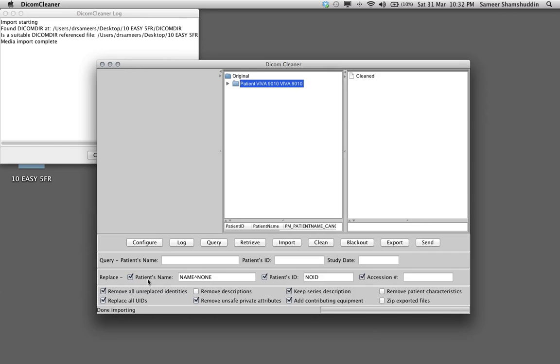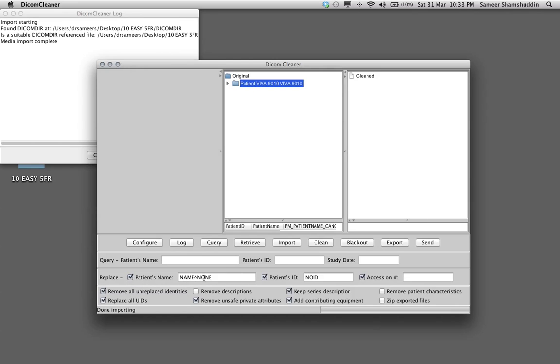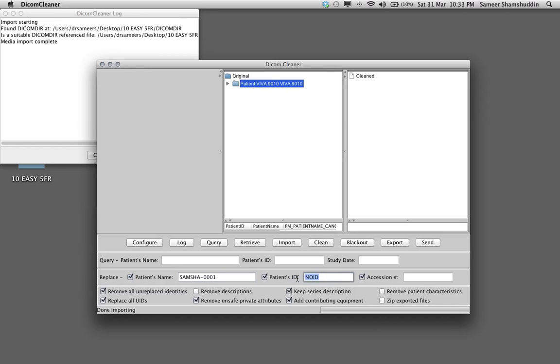If you look at the bottom part of this window you can see the section called replace. Tick all this box, replace patient name. I will put this according to the case code we have already discussed on the website. So my case code will be SAMSHA-0001. This is my first case and I will keep the same patient ID SAMSHA-0001.